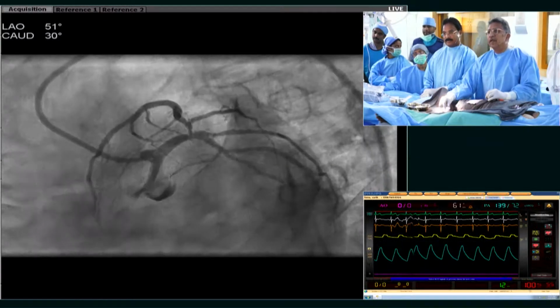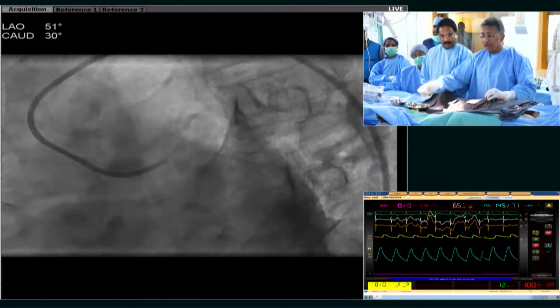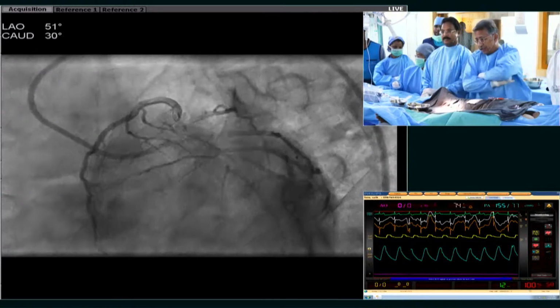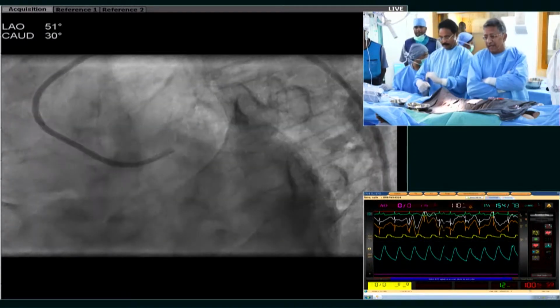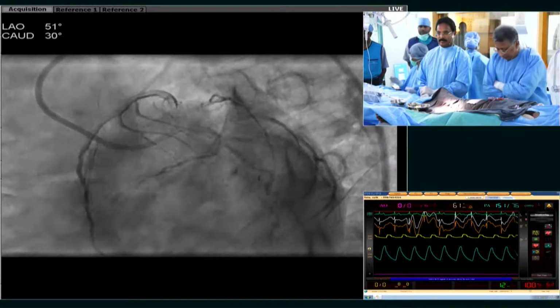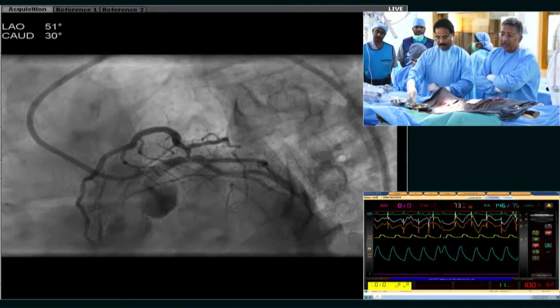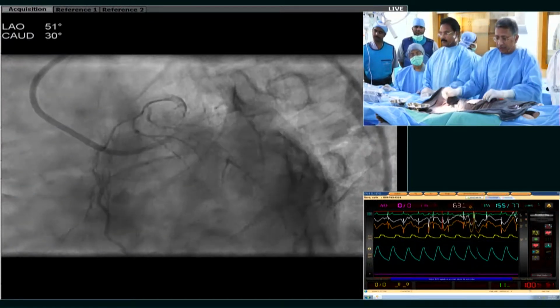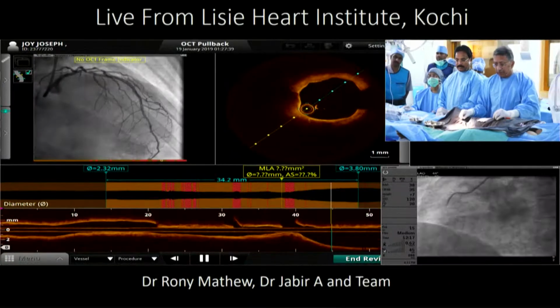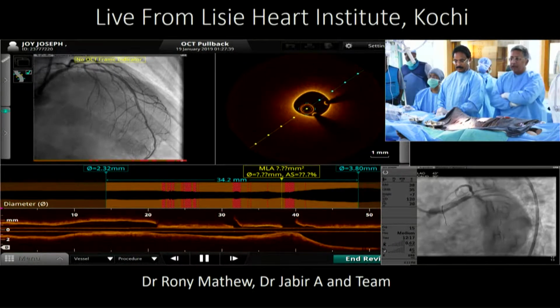Yeah. All right. So what we initially thought from the angio is that there was a lot of calcium, and especially since it was an LAD ostium, we thought we should go and do a rotablator and cut over there. But as Dr. Nicholas suggested, imaging is a must, and we did an OCT pullback. Let's go to the next one, please. Shall we run the OCT? Yeah, next shot to show the OCT. So I have run the OCT over there, and we have co-registered that.